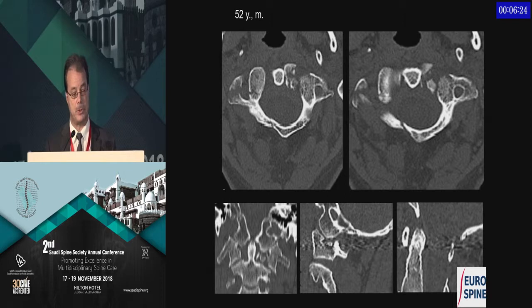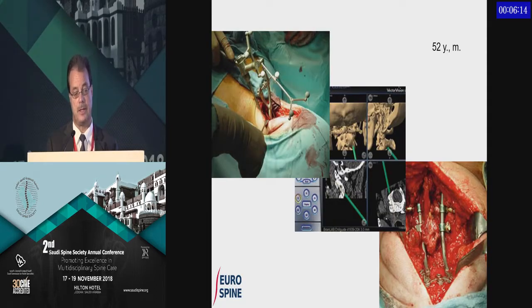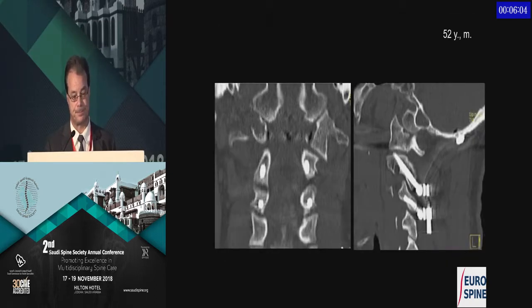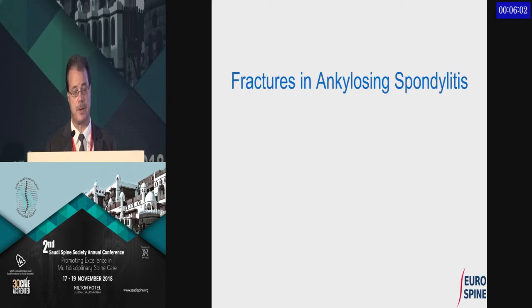So that would be the situation, and you see there's a dislocation of the atlas and a highly unstable situation. So this needs again a stable fixation, and that was achieved with this occipital-cervical fixation. That's the post-op. That's the patient.